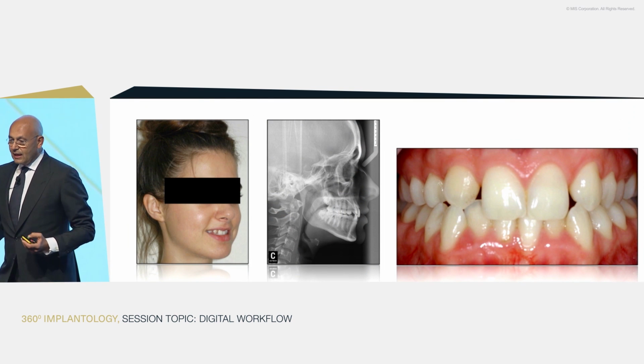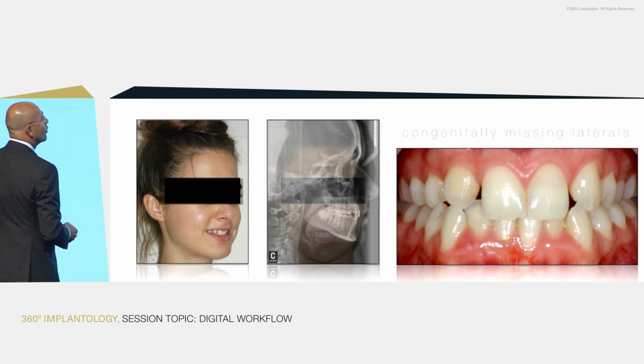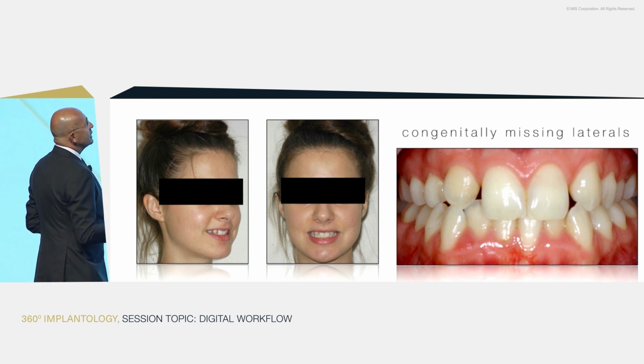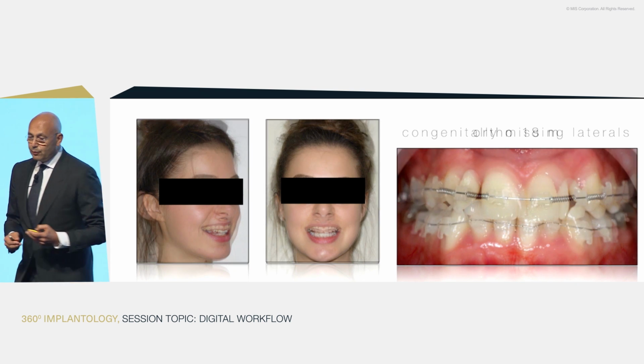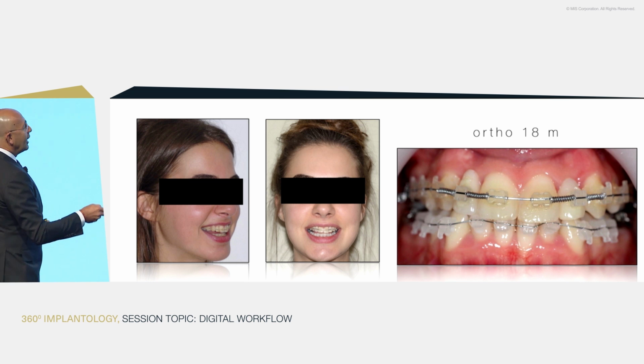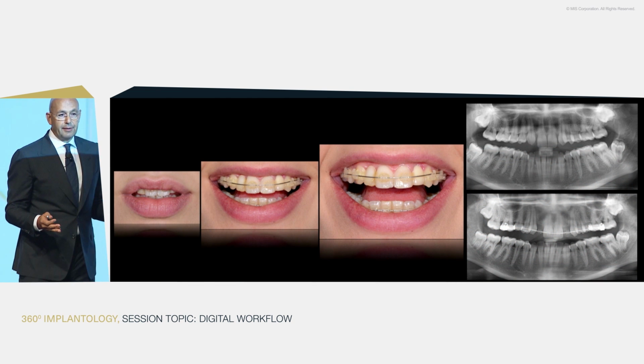Now, the last patient, conventional custom design. What happens here is that I didn't know the patient. The patient had been treated by an orthodontist. She had congenitally missing laterals, very sweet patient. And simple enough, this is after 18 months, and this is when the patient was referred to me.